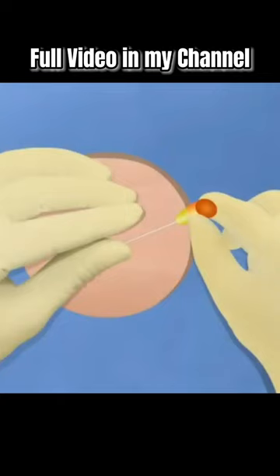Once the needle is in place, instruct the child to relax and breathe normally. For a young child, maintain the child's position and restrict movement once the needle is in place.